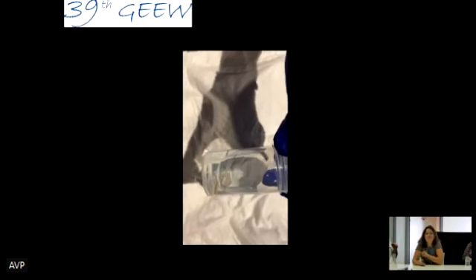So there we are with the whole device, and this will be sent to the pathologist. It's our pathologists that do that. We don't do the brushings like that, but some centers, of course, they do it. Also for the US guided FNA, FNB.